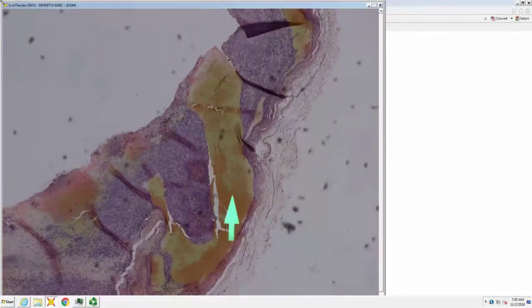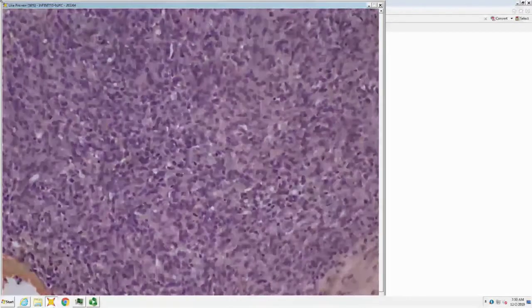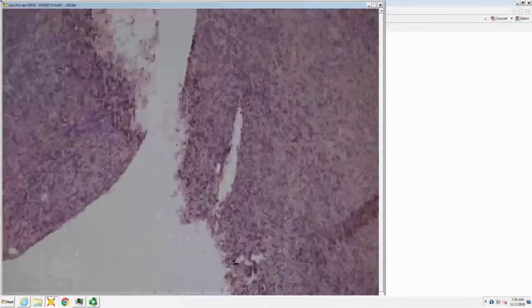Okay. So there is, I think, bone? Blood, okay. So dilated vessel, blood. Alright. Hypercellular tumor. There is a little bit of lymphoid inflammation. Hypercellular tumor, some mitoses. It's a deep soft tissue tumor.